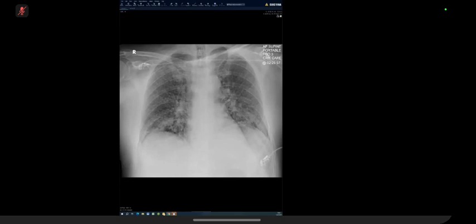So ask the right questions now. I will correlate with any previous radiographs, if available. Also correlate with inflammatory markers. Ask the examiner the history. You have to ask it before they offer it. Rather than say, may I have the history, you can say, I would be interested in knowing the history of the patient. And then you pause. And I would say, immunocompromised.